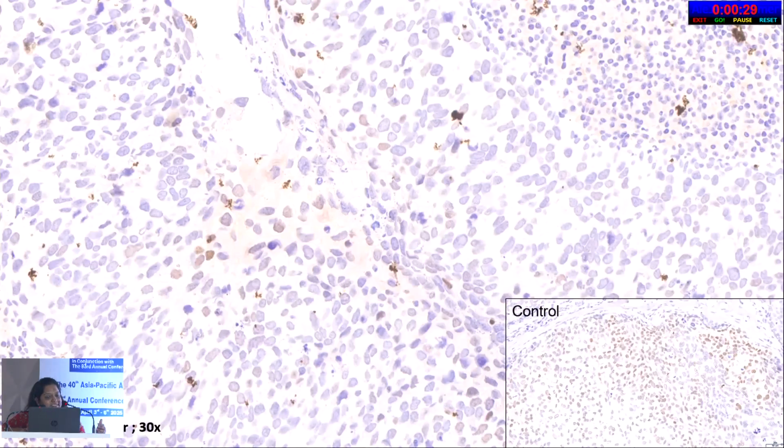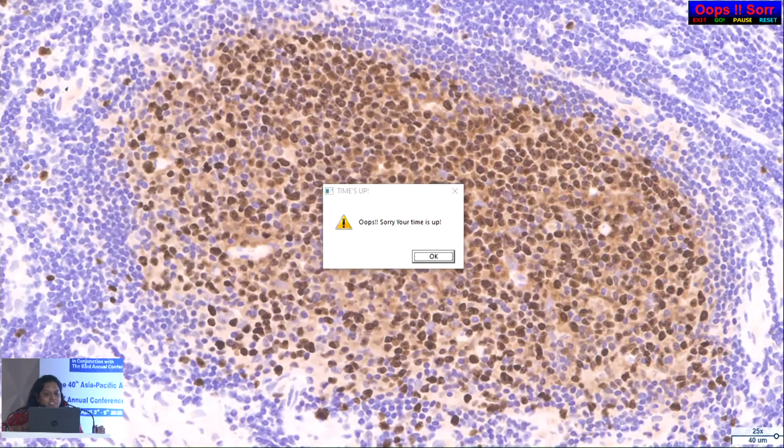Now, this is an androgen receptor antibody. What do you think might have happened? You can see that the control picture is in the inset, while there is scant or very faint staining. What could be the issue? This could be because of insufficient antibody, because few of the cells have been labeled or are showing expression. So this is another case, of a lymphoma. Here you see that there is inadequate application of the antibody. Here what you see is endogenous cross-reactivity with immunoglobulins.